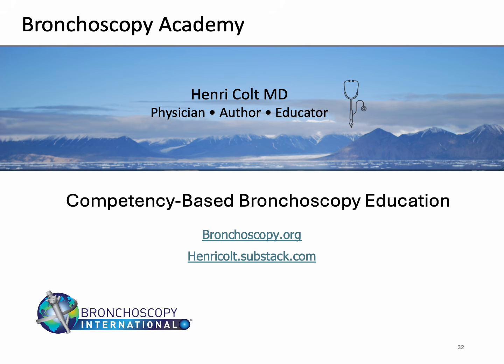Bronchoscopy Academy is part of an ongoing competency-based approach to bronchoscopy education. Our goal is to reduce patient suffering caused by unequal procedural expertise, inconsistent training, and preventable error.